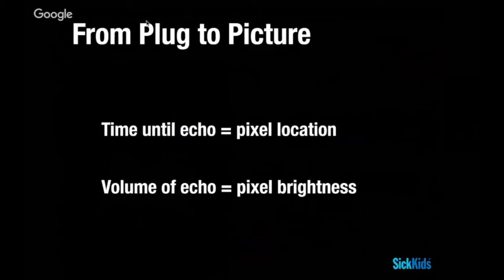And just for information, I believe the speed of sound within human tissue is like 1.5 kilometers per second. In terms of pixel brightnesses, you've got like 256 grayscale units on most machines in terms of how bright they can range between.